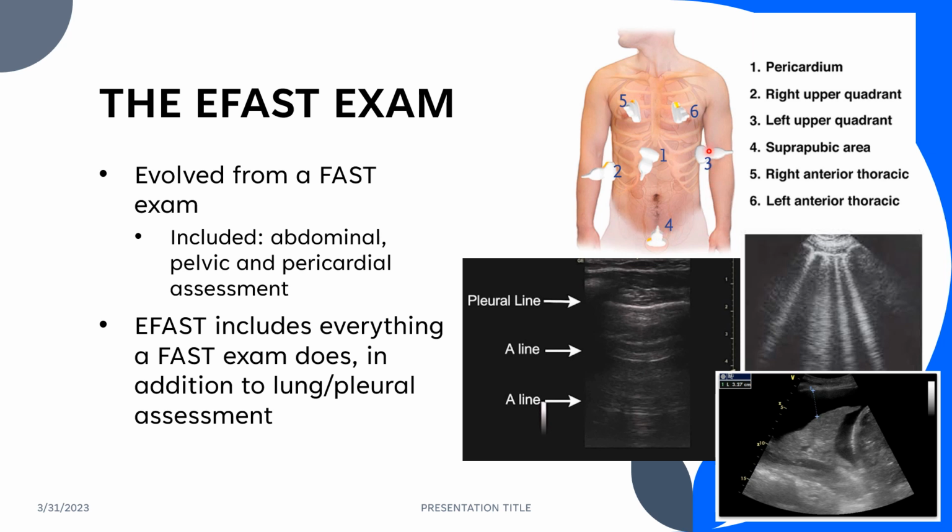Then we can go up here to the left upper quadrant. You're going to treat this very similarly to the right. You would slide up to get above your diaphragmatic area here.